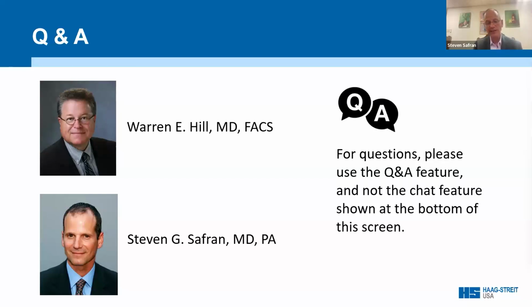Because when I do the toric lens, I want to make sure, is this somebody who's a face sleeper? They have asymmetric astigmatism, coma, all of these things, keratoconus, you're thinking about these things. And you want to make sure that whatever you put in is going to be based on reproducible measurements that reflect the patient's constant state. You make sure that they're out of contact lenses long enough, that their ocular surface is tuned up. But when the data line up, when the topography axis and the Lenstar axis, the Ks and the refractive axis and what they're wearing in the glasses, when all that lines up, it's very, very confidence inspiring.